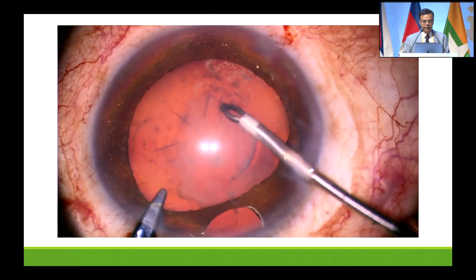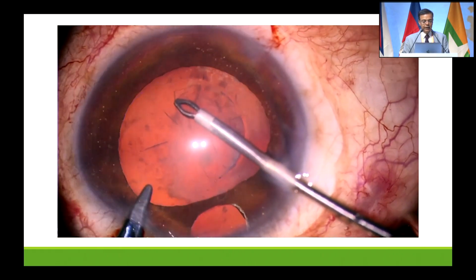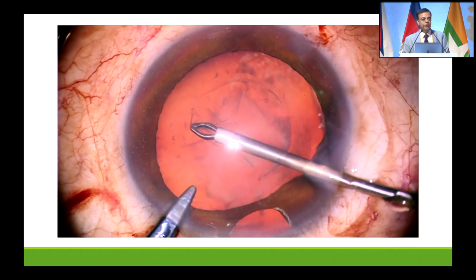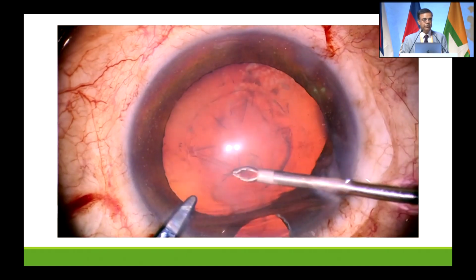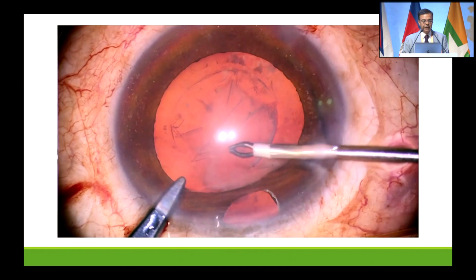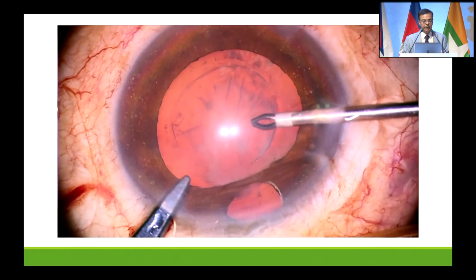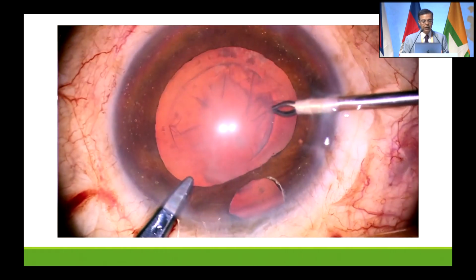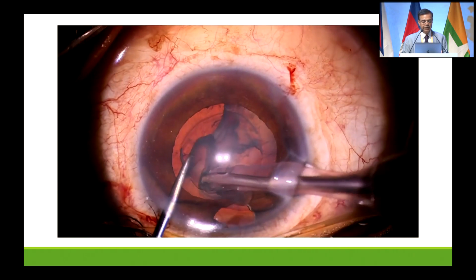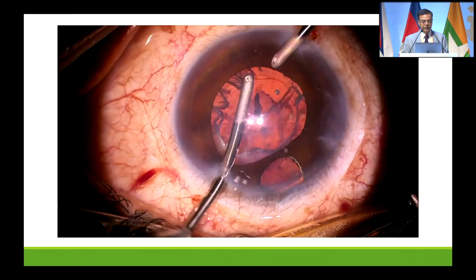Now, the reason why the rhexis is not complete is something we didn't know before this case. It was incomplete because of the silicone oil bubbles in the chamber. Silicone oil is not penetrated by the femtosecond laser. So when you have oil bubbles in the chamber, never use the femtosecond laser for your critical steps, because it will not be able to go through the oil, or else you can wash out the silicone oil first and then use the femtosecond laser if you must. We did manage to get away because we had to complete the rhexis and everything.